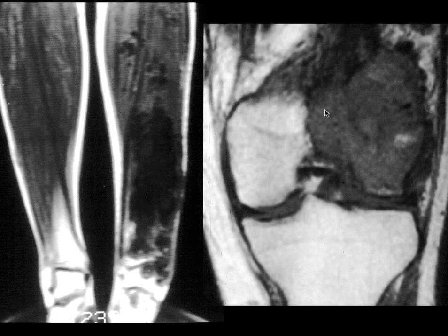And it's just an example of tumors that can be seen very nicely, separating fat with a short T1 from tumors, which are primarily water, which has a longer T1 and therefore doesn't give a very good signal.